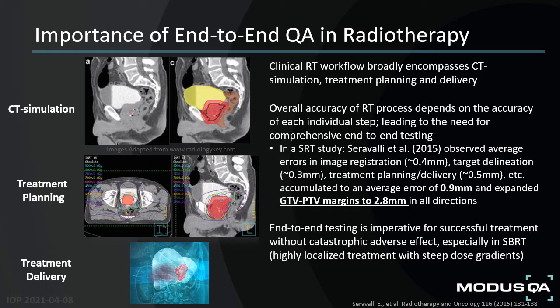Finally, there is a treatment delivery unit, in which the treatment plan is transferred into quite often a LINAC, and upon verifying the patient position, the dose is then delivered with a very high degree of accuracy.